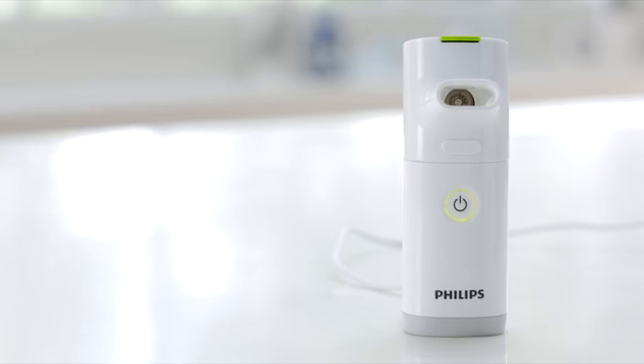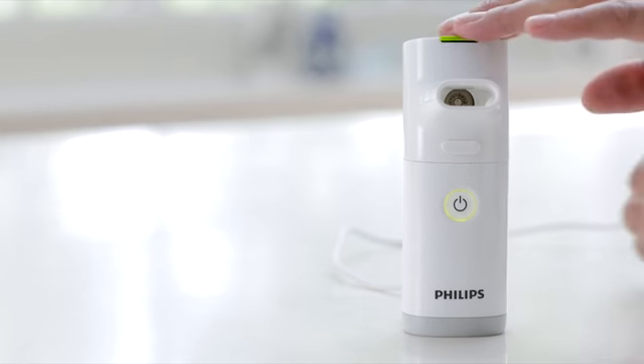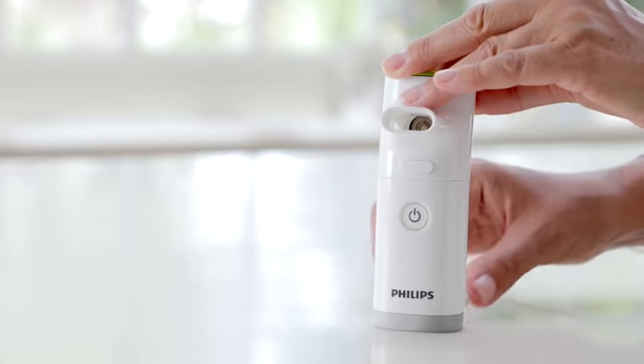This should take about 2 hours and a fully charged battery will provide approximately 30 treatments. Once fully charged, it's important to unplug the power adapter from the handset and the wall outlet in order to maximise the life of the battery.